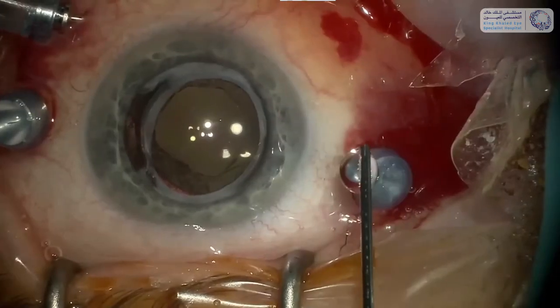Here you see the subretinal hemorrhage. We only do the surgery if the hemorrhage is less than one week old.